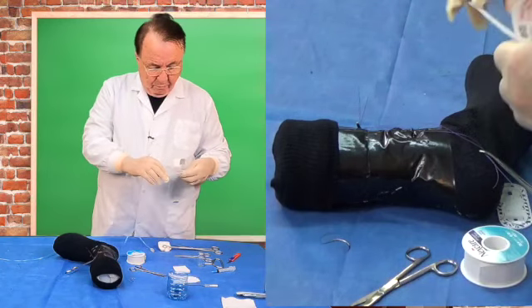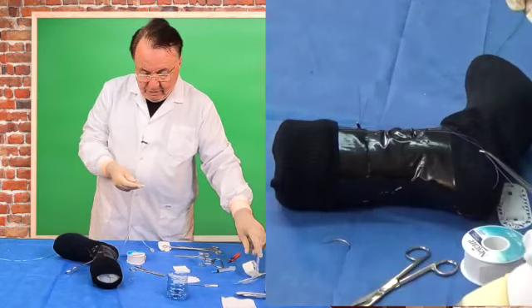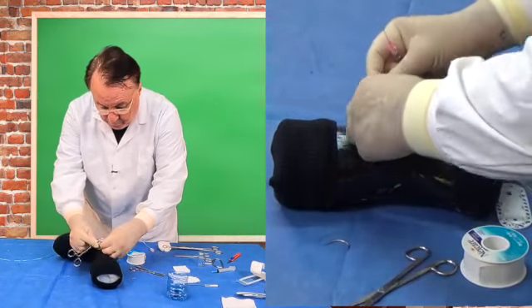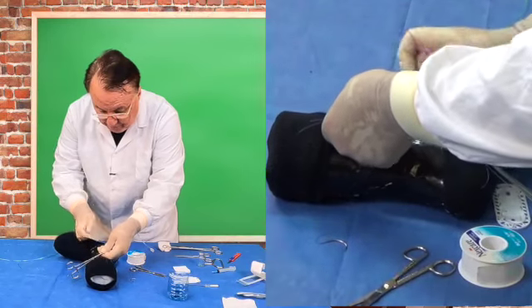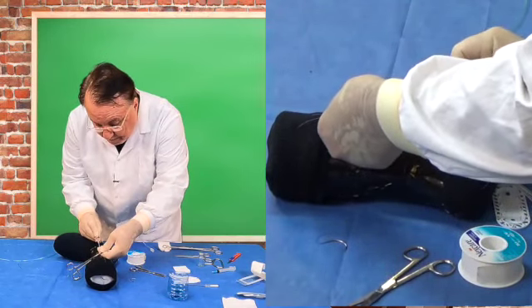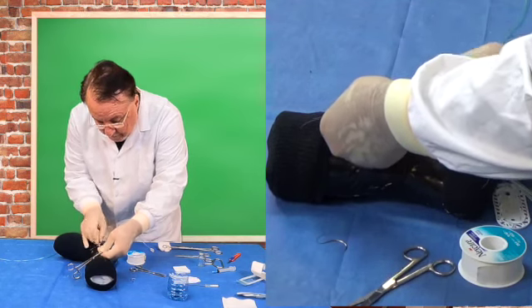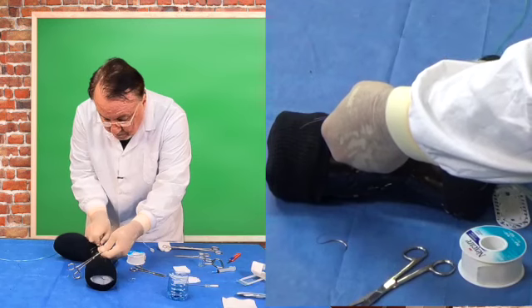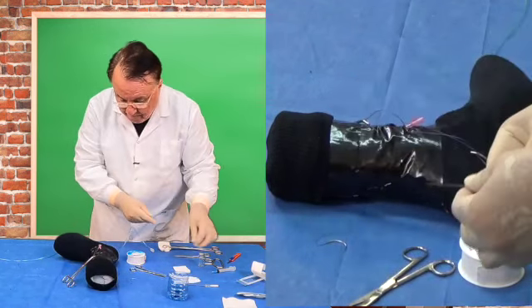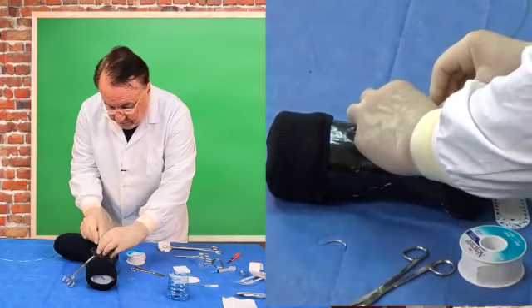You can put any IV of your choice in there. I'm just going to use a catheter. I'll lift it up, insert it in the vein, advance it, take out the needle. I'll then attach it to an intravenous.